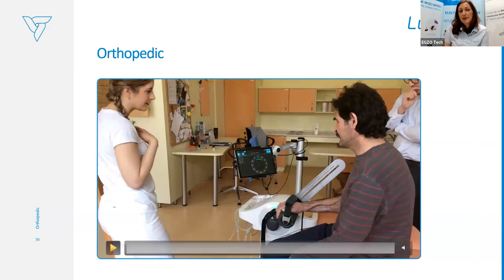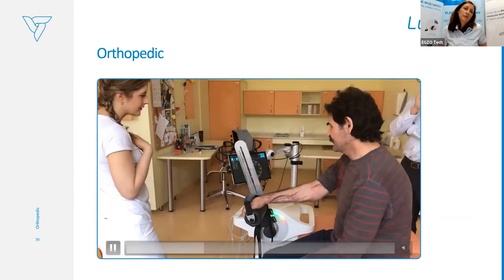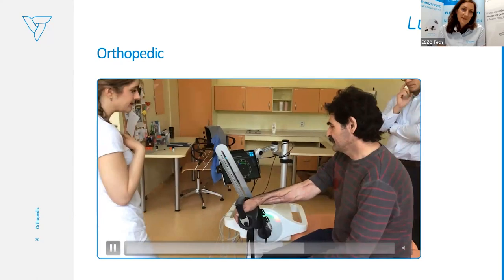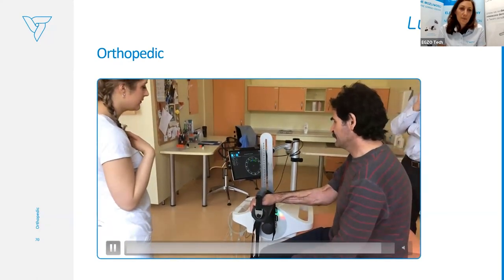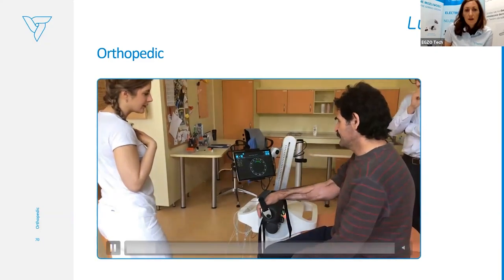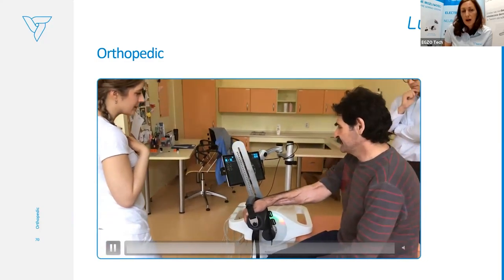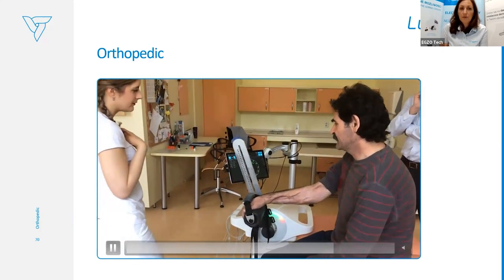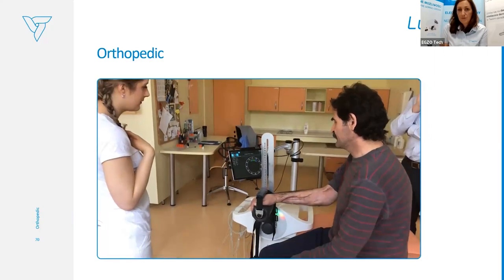Here you can see an example of providing therapy in a more functional way, addressing the problems and needs of the patient. This is a driver who wants to return to driving a car after injury. He wants to work on how to change the gears — so here we can apply both active and resistive training for this movement.